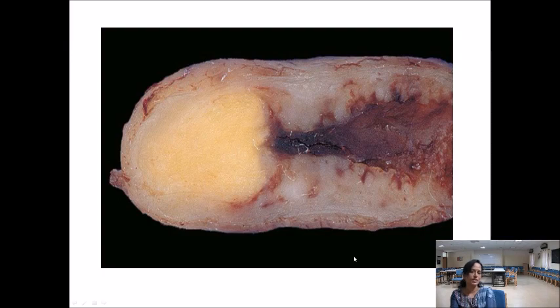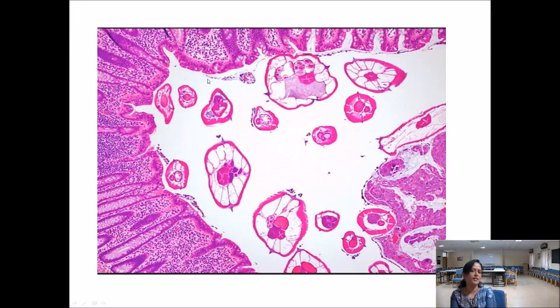This is how carcinoid appears. Yeah. What are these? This is the lumen of the appendix. Okay, these are not any glands or anything. So they're all transverse sections of something. See, all these, they're not native to our body. All these have a thick chitinous wall, such a nice wall. And if you carefully see, this is the cervical region.